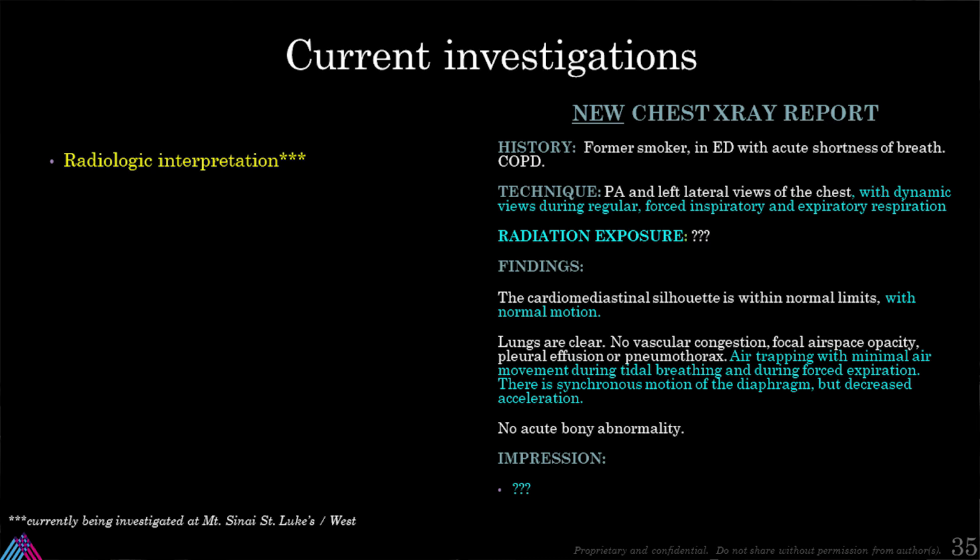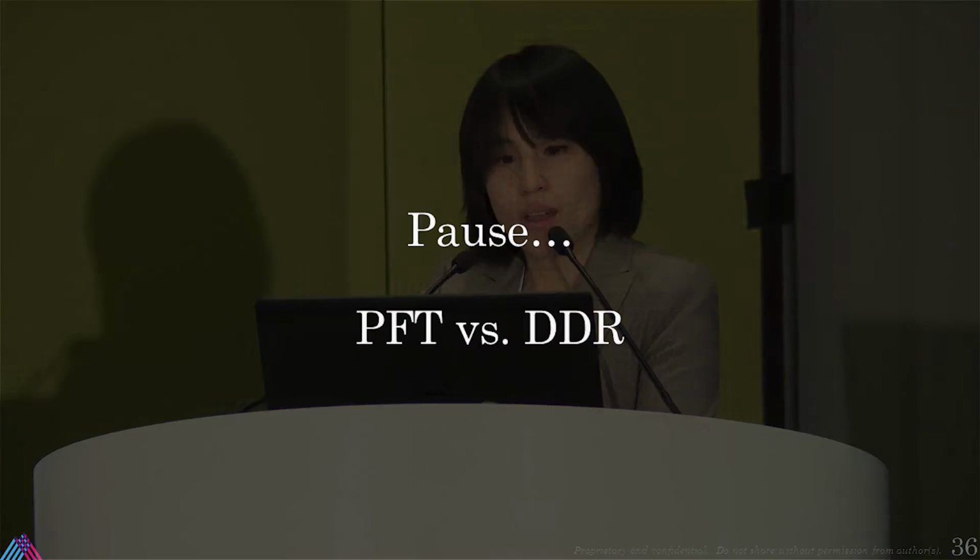I'm sure a lot of chest radiologists in the room can tell you there's upper lobe predominant disease, lower lobe predominant disease, and things that you can probably see functionally different that pulmonologists were not able to describe before, other than auscultation to the back of the lungs. And that's really different and a new way of looking at disease, I think, that I'm very excited by. So now we're going to pause a little bit and go into that pulmonary function test that I alluded to.